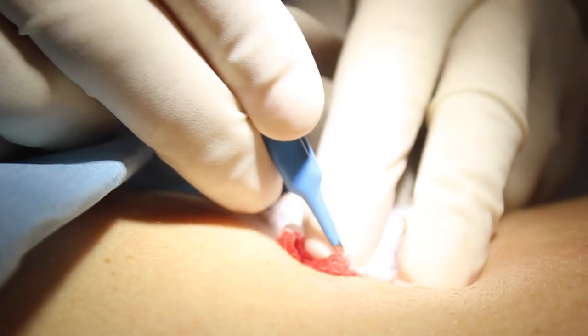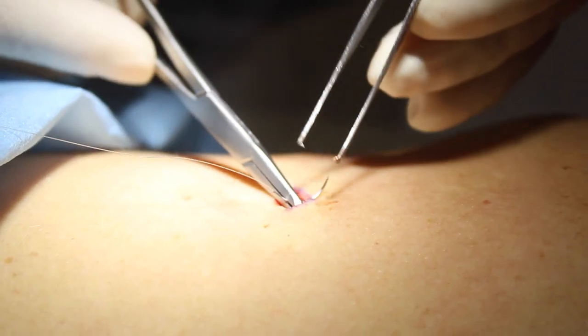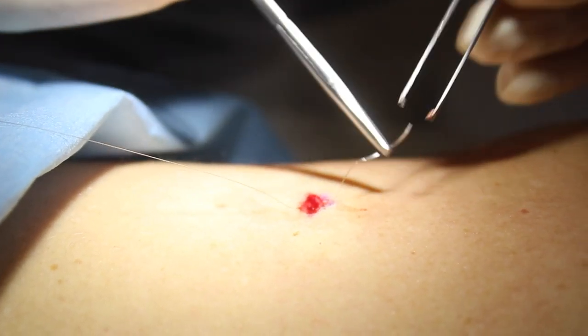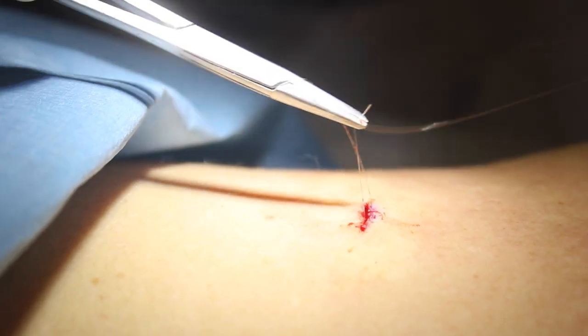These blue forceps are an electrical device called a bipolar diathermy machine, which passes electrical current through those little prongs. That cauterizes the blood vessels, which stops any bleeding.